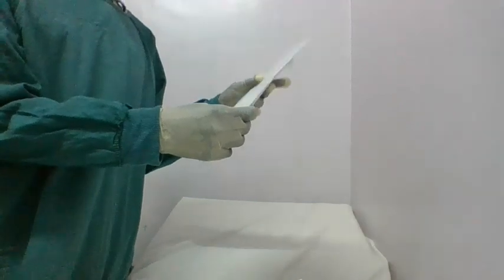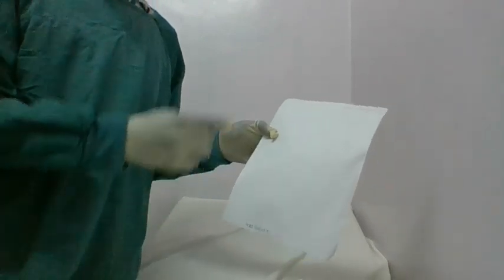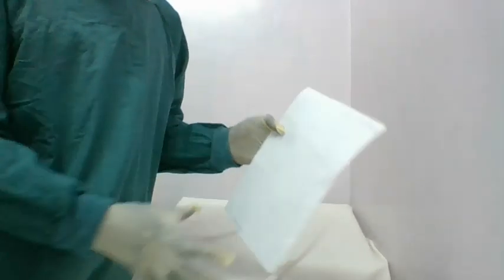Guys, remember to have a vital taking sheet. On the vital taking sheet or chart, you are going to chart your readings of the vital taking from the patient. Basically, it is very crucial while in the wards where there's a patient that you are monitoring or managing. So you are following up. Maybe you are taking the vitals half hourly, quarter hourly, or after 2 hours or after 4 hours. So guys, you need to have that chart that is going to guide you very well on charting each and everything that you're doing.